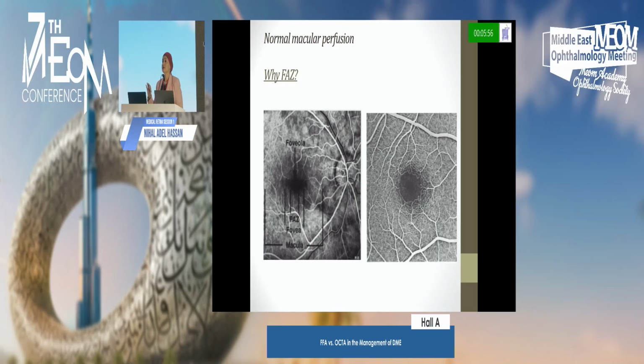And the retinal ischemia, which we are mainly concerned with as regards vision, is in the macular area, with the foveal avascular zone. And to have this beautiful picture of the capillary network in the foveal avascular zone, this is my own photography. It's not from the literature. It's from an ordinary fundus camera, an old Topcon fundus camera. I am not having any financial interest in anything. But I mean how the capillary network we should be concerned with, because this is the first and the very important point that we comment upon for the patient in the report, because this might be the only cause for drop of vision, which is the macular ischemia.